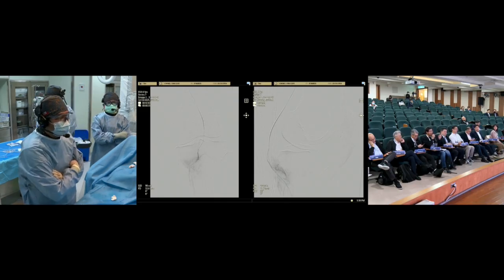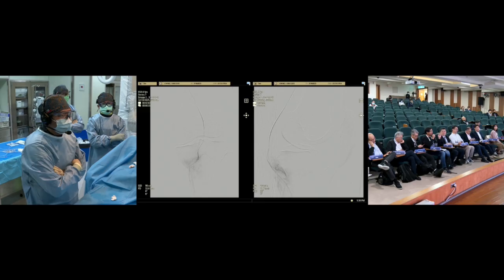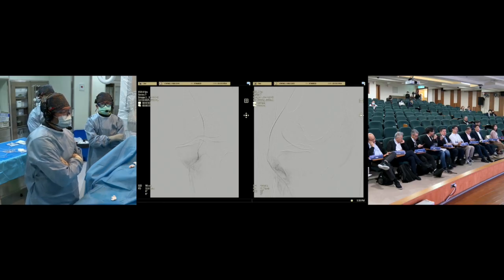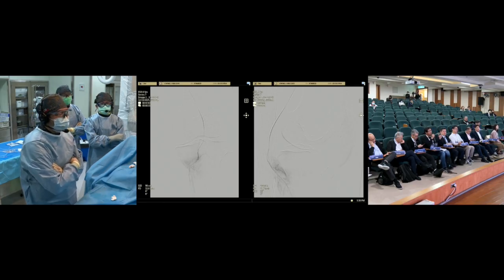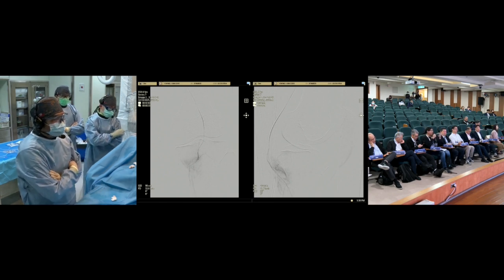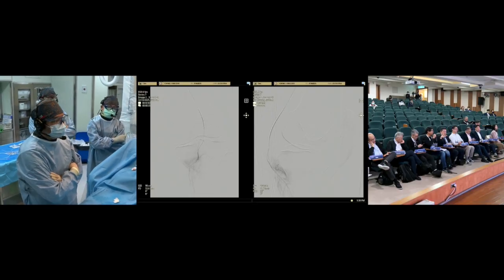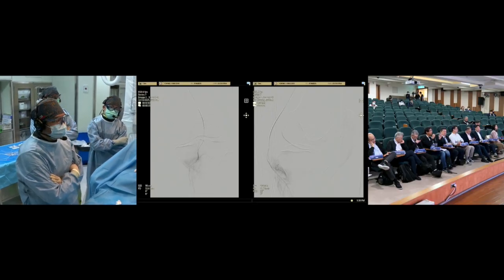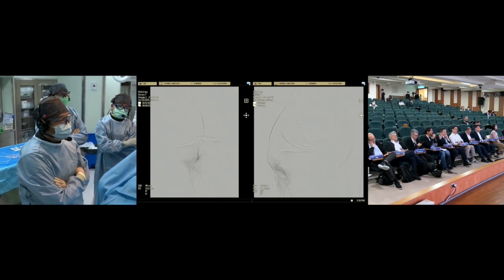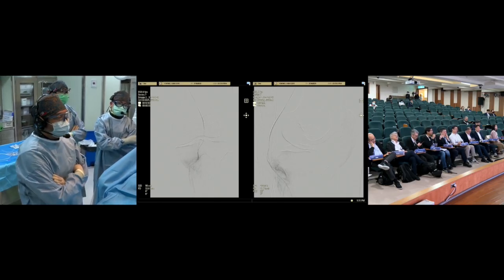The reason I ask the question is that neovascularization sometimes, in pain control opinion, may be evil, right? But sometimes neovascularization may increase tissue healing or something. So if you treat all the moya, maybe the patient underwent surgery before. Will it decrease the healing or something?